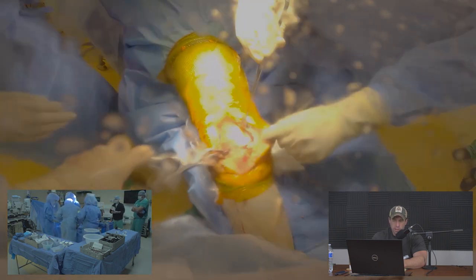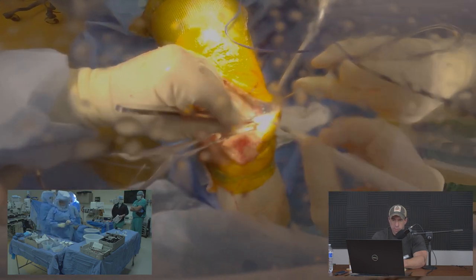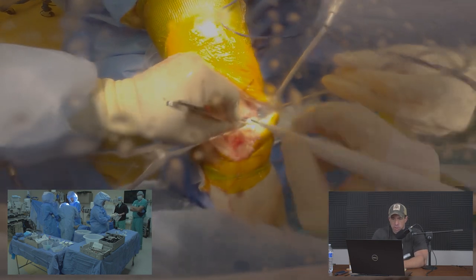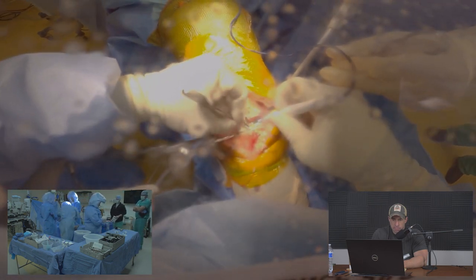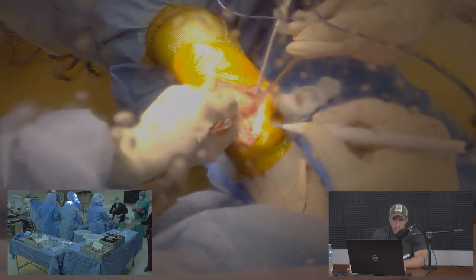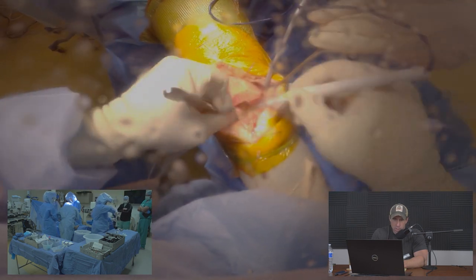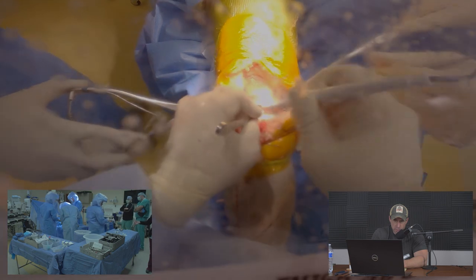The knee is brought to extension using a spreader to tension the ligaments, allowing me to see and remove the medial meniscus remnant. Some surgeons do this in flexion — I was trained in extension. Moving carefully to the center of the knee, I remove the remnant of the posterior cruciate ligament, being very careful not to enter soft tissue structures in the back of the knee.